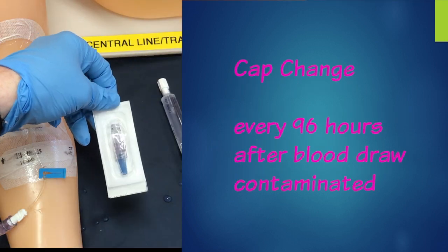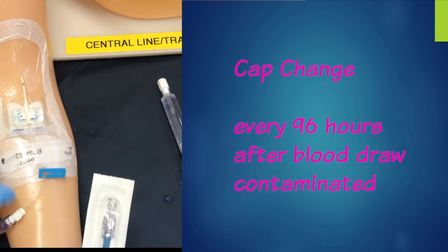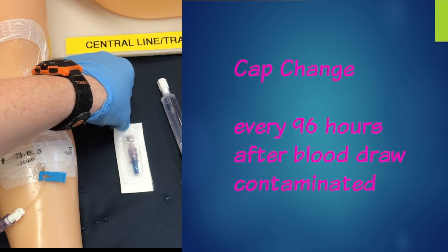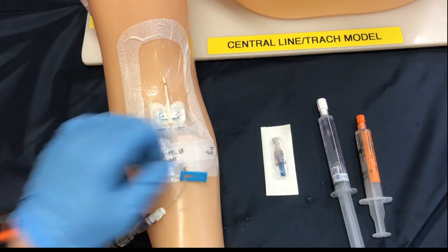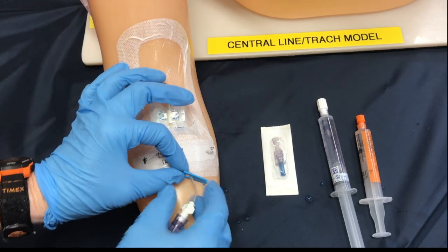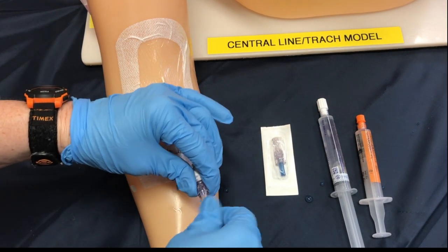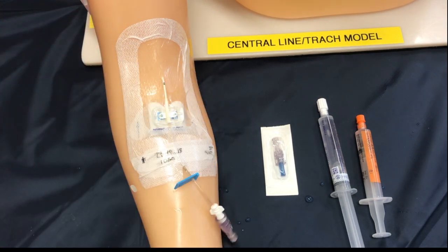Now I'm going to combine this with a cap change. This is done every 96 hours, after blood work is drawn, or when it looks contaminated. If you're not needing to do a cap change at this time, simply follow the process without the cap. The supplies I need are my cap, my saline flush, and my sodium citrate or heparin depending on what your facility uses to lock. I'm going to lock off my line now that the infusion is done and simply detach my line — the neutral connector is still connected to the PICC line at this moment.